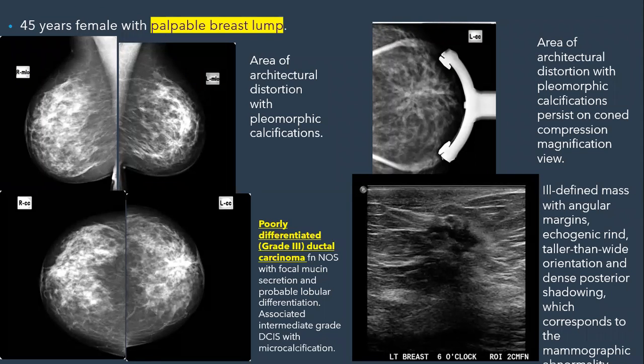You see, false negative up to 4.5 or 4.4%, I don't remember exactly, in combination of both mammography and ultrasound. So if the patient has a palpable abnormality, that is why we put the analysis to make sure there is architectural distortion, along with other measurements to look for the clinical. Clinical is essential, very essential.